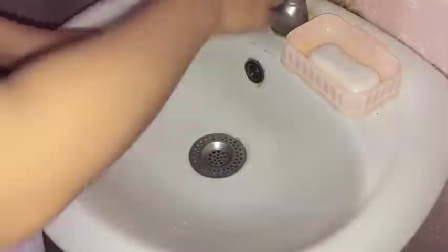So first things first, let's check the doctor's order and check the medication administration record, and of course check if the label of the medication being prepared is correct. So now let's organize the equipment, and of course let's perform hand washing to prevent the spread of microorganisms and observe the appropriate infection prevention measures.